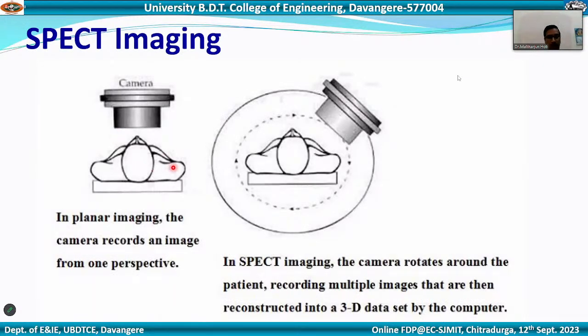Through a particular injection medium, we inject the radioisotope. It goes into the body, and at the particular body part you need to generate an image, we keep the camera. The camera has radiation detectors that capture the radiation emitted from the body and collect the data. In CT, the only difference is that we are passing X-rays, which penetrate through the organ, come out, and fall on the detector.